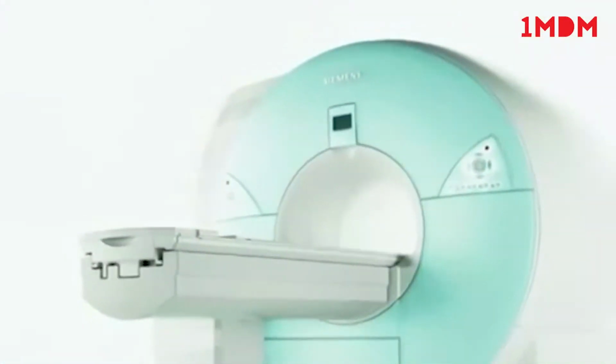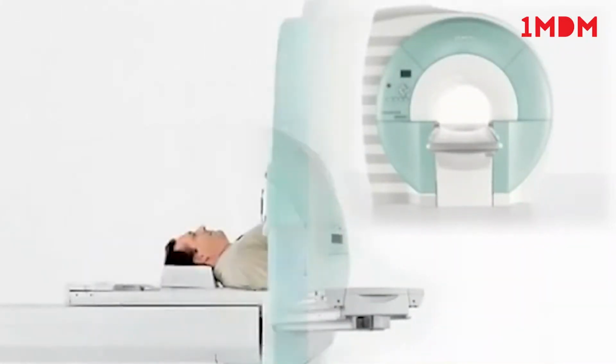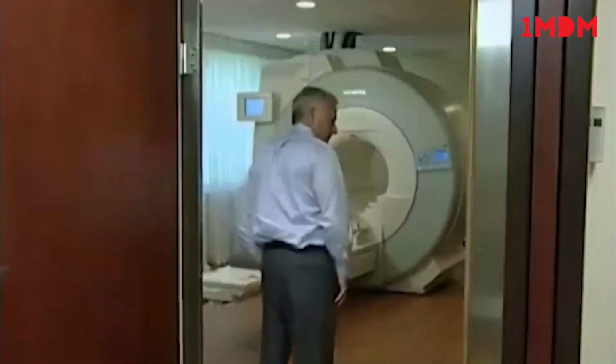resonance imaging system. You will be introduced to different magnets and learn the effect of those various magnets. Examples will be used to demonstrate the strength of the magnetic field and the dangers faced when handling magnetic objects in the examination room.